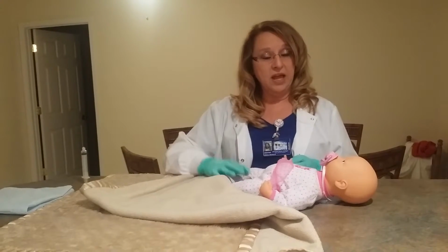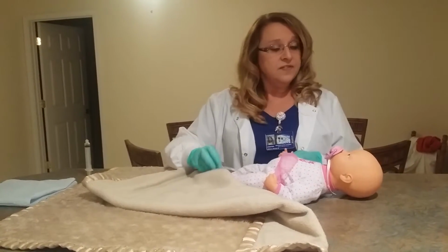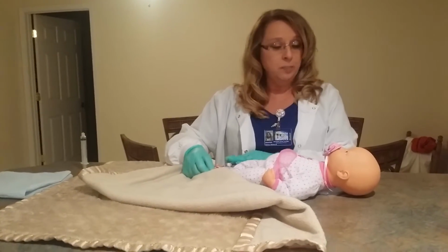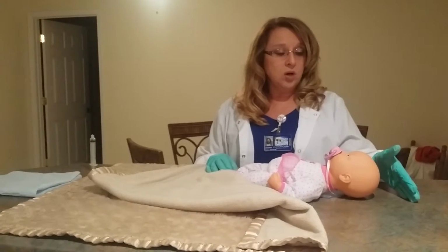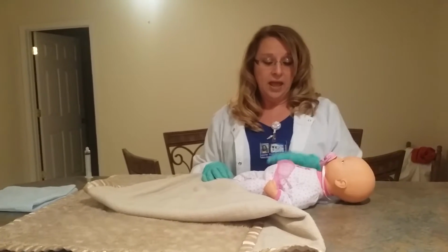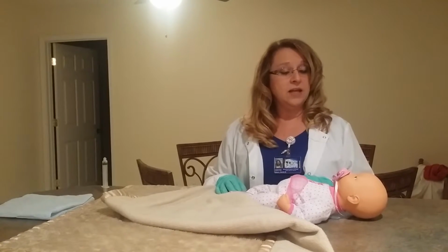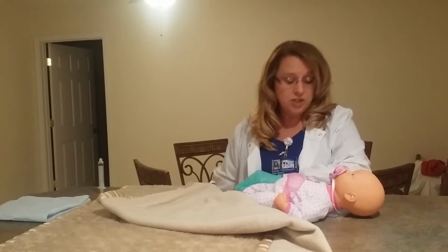After this, you explain the procedure to the patient. Ms. Smith, today I'm going to be removing this Foley catheter, this tube that's going up into your bladder to drain the urine out. It's a relatively short, painless procedure. I need for you to inhale deeply and then let your breath out. Upon exhalation, I shall be removing the tube.